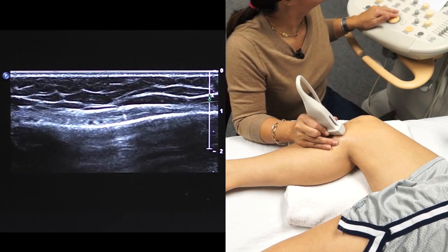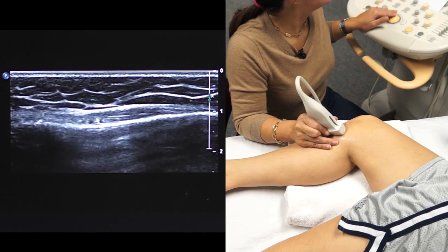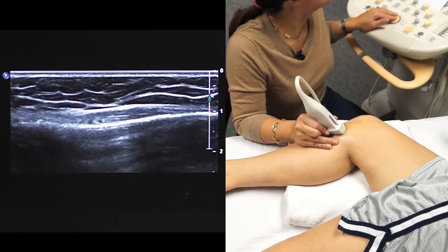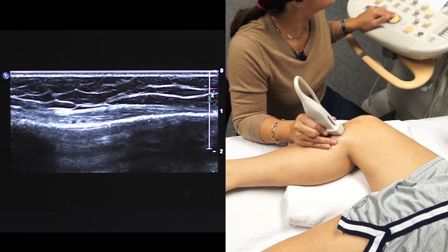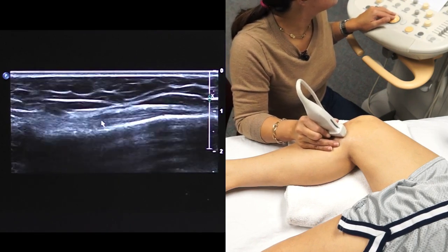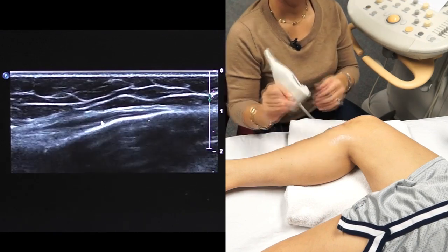Sometimes you may only see a little bit of thickening at the insertion, or you may see a bursitis, which is fluid around or deep to the tendons at their insertion. When they're normal, they can be very difficult to see. Okay, and that's the medial knee.